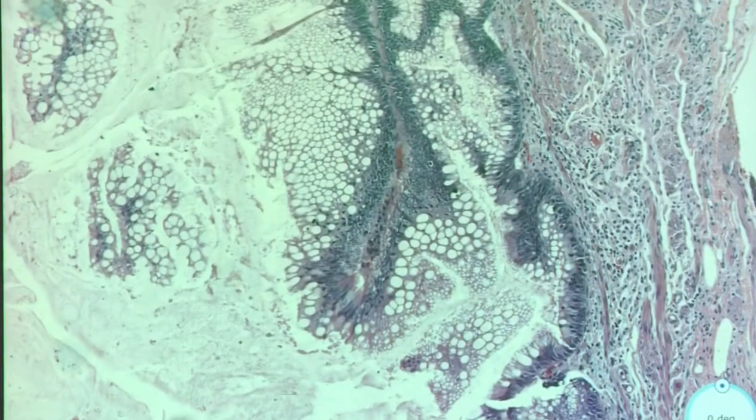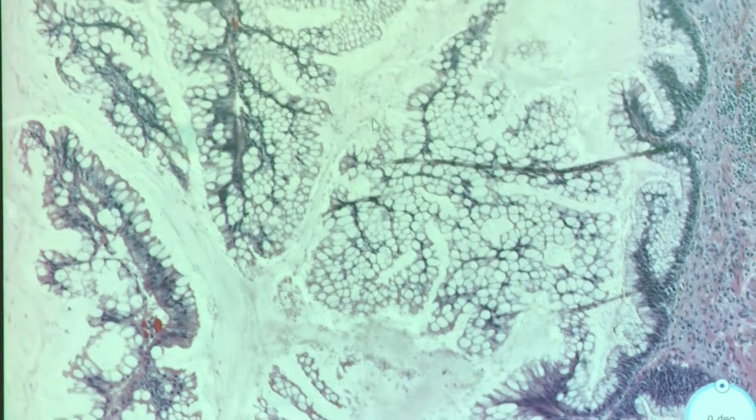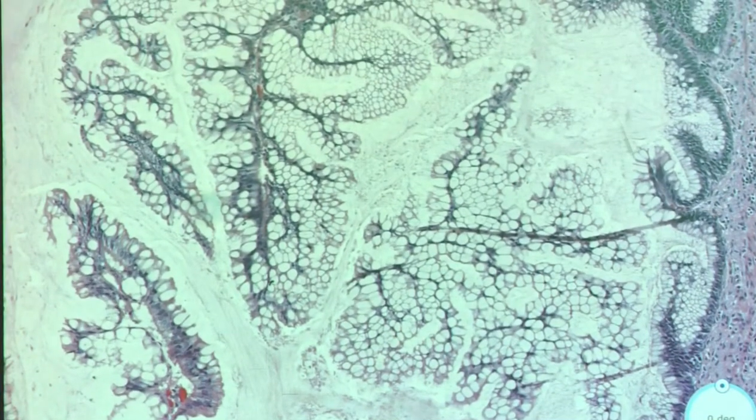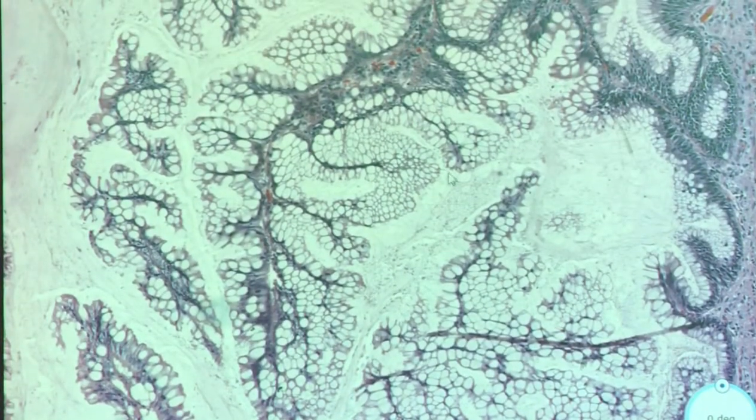All this irregularity. It's almost like a sawtooth. So this is what we refer to, even though I know, granted, this is not the best example. Again, here, some of that sawtooth irregularity. So this is what we refer to as, like, okay, we're looking at maybe serrated areas, and we have all this mucinous stuff going on.